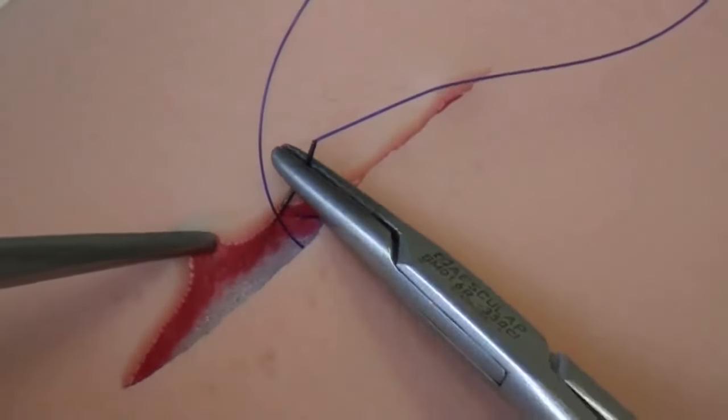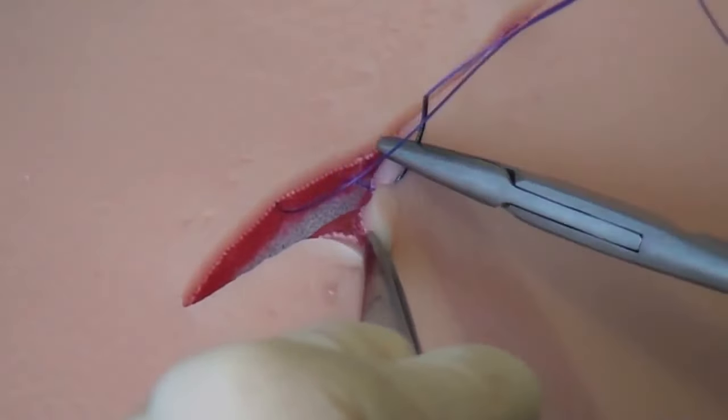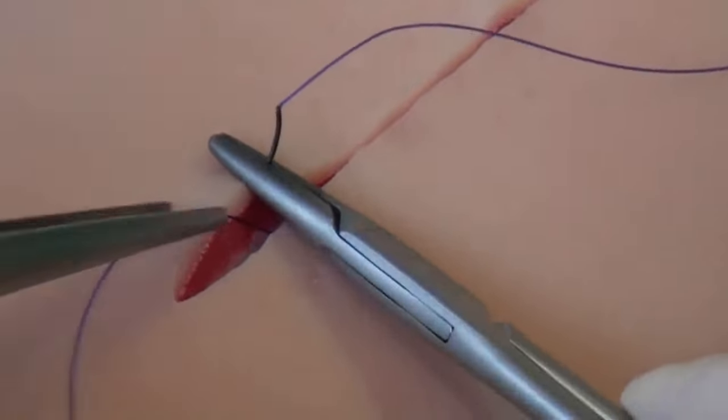The subcutaneous suture is placed in every form of operation in which the skin has to be closed again. In some cases, it is not done as a continuous suture — for example, when the wound is infected. If this is the case, the subcutaneous tissue is closed with single interrupted stitches, so that the areas can be partially opened up again.